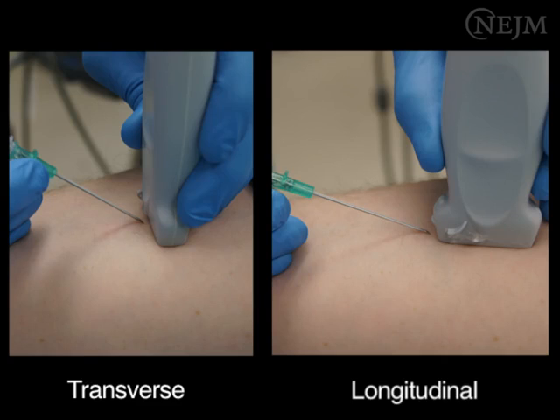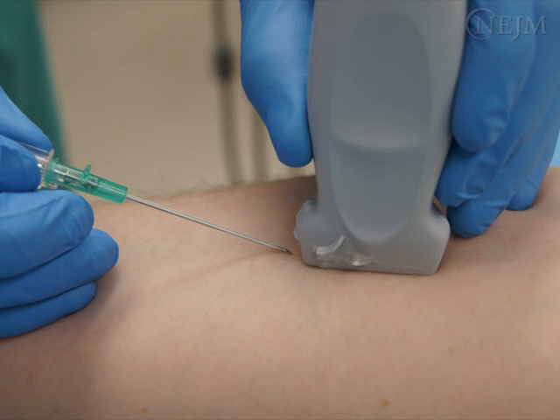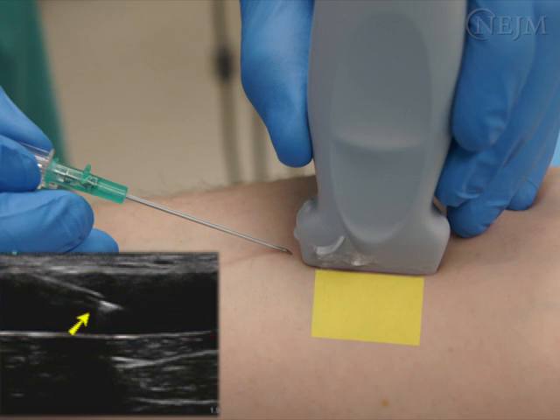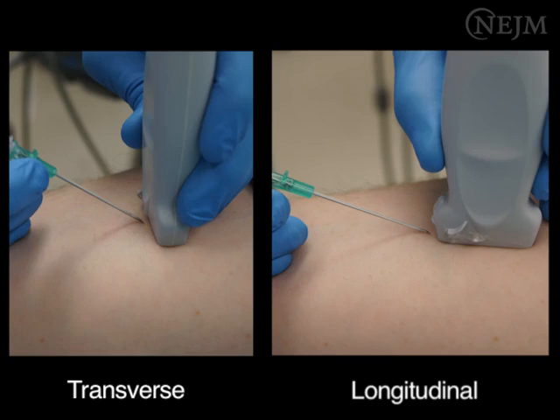Transverse or longitudinal describes the orientation of the ultrasound plane with respect to the vein and the needle. In the transverse technique, the ultrasound plane is transverse to the vein and the needle, so the vein is circular and the needle is a single bright dot. With the longitudinal technique, the long axis of the vein and needle are in line with the ultrasound plane, so the vein appears as a tubular structure and the entire needle is visualized. The transverse technique gives less information, but is easier to learn and is recommended for novices. The longitudinal technique is more difficult to learn, but is preferred by many experienced providers. We will demonstrate these techniques and explain why it is best to learn both.